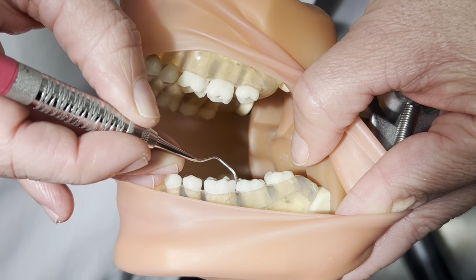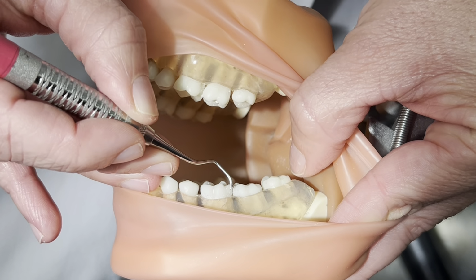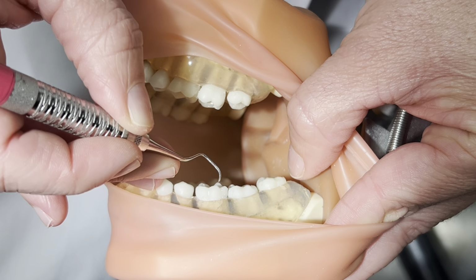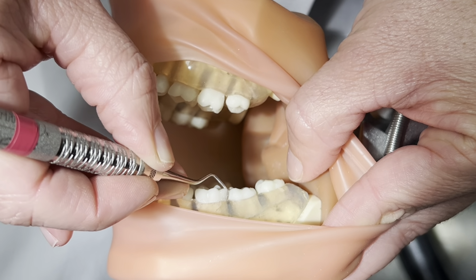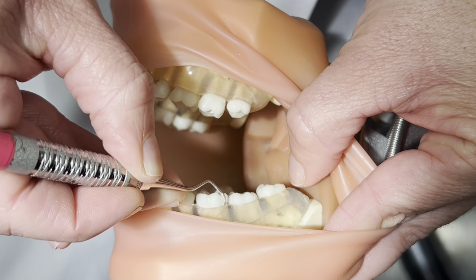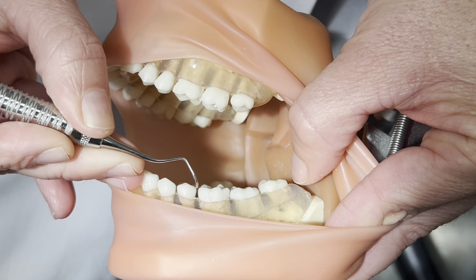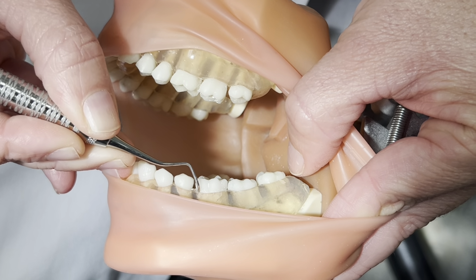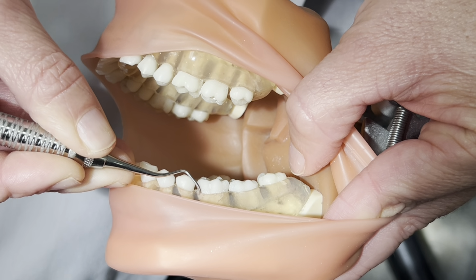For a horizontal stroke, you want to make sure that the toe of your instrument, so this part, is directed towards the sulcus. We apply these strokes for this tooth only at the line angles, so distal line angle and mesial line angle, keeping that toe of the instrument directed towards the base of the pocket.